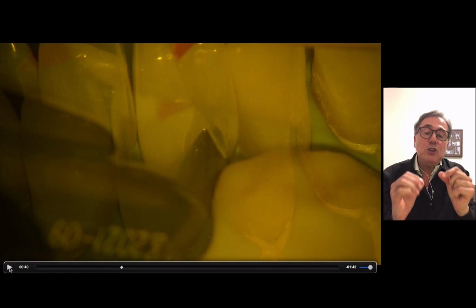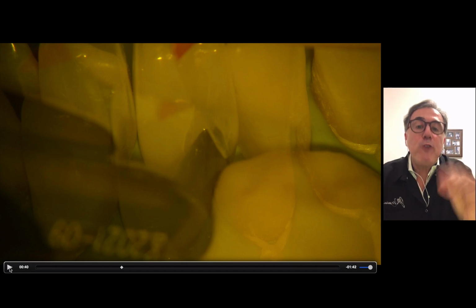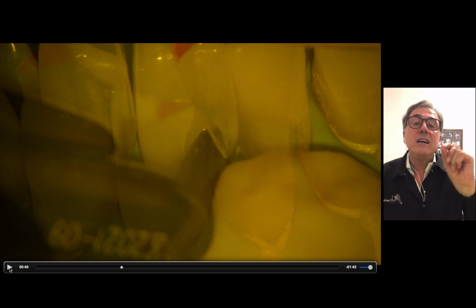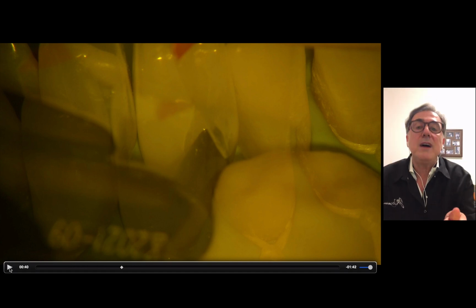So first you're going to inject, between the matrices inside that aquarium, a heated flowable composite. Then you don't cure it. You don't cure it. And then you inject a heated restorative composite, which in our case here we're going to use the Filtek Universal. So you inject the heated flowable, and then on top of the flowable, you inject the heated composite.